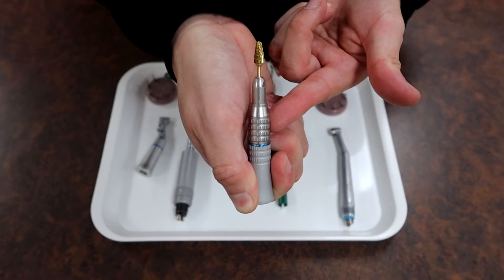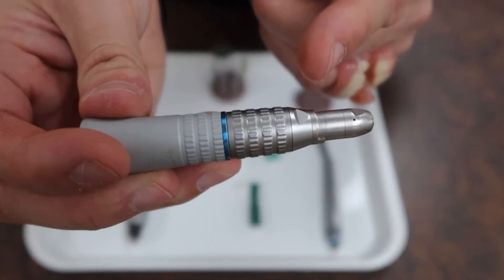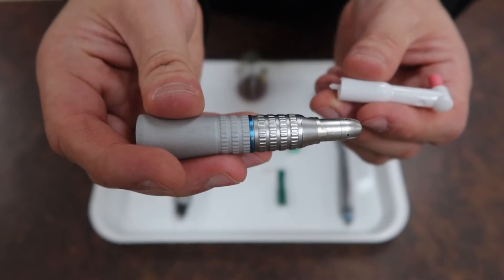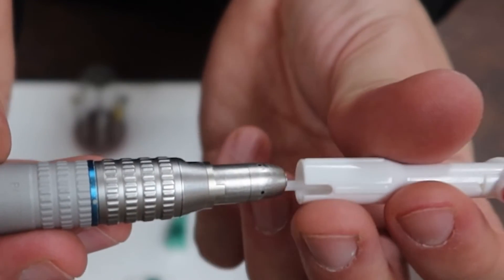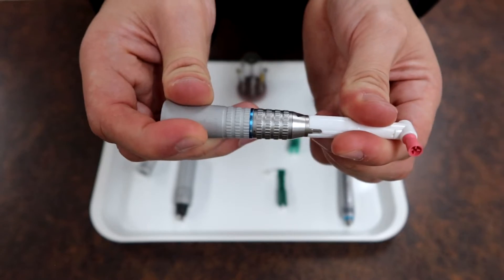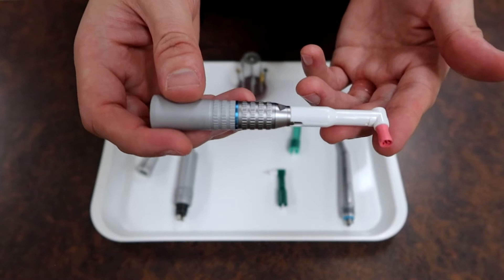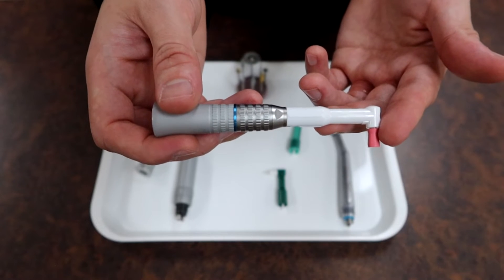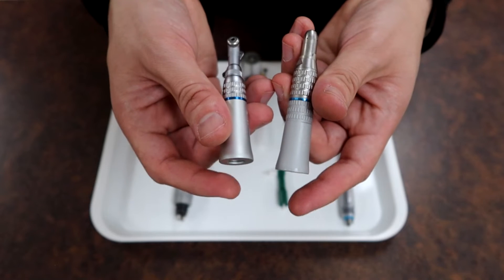Instead of using the nose cone for a laboratory bur, you can look at the keyhole on it and attach a prophy angle, which has a little cutout that mates with the keyhole. Slip them together and lock it up, then give it a little tug to make sure it's nicely stabilized — it should spin without any issues. This is useful for a dental assistant to polish a patient's teeth after a simple or routine cleaning has been performed.